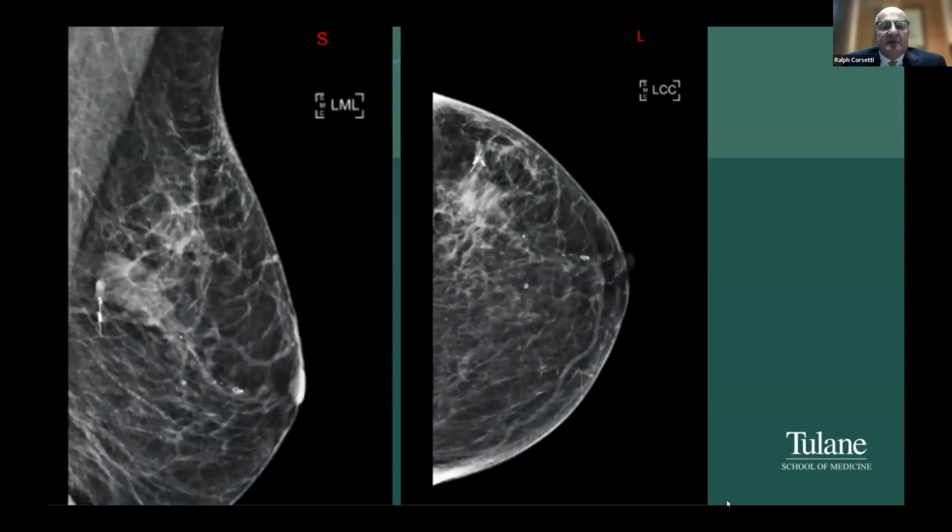She did well postoperatively. So here you see the Scout reflector on this mass. You see the biopsy marker in the reflector. They're actually slightly posterior, inferior, and lateral to the lesion. So intraoperatively, I'll direct my lumpectomy so that it reflects the eccentric nature of the marker and the reflector, so that we can try to centralize our pathology specimen within the center of our cavity.